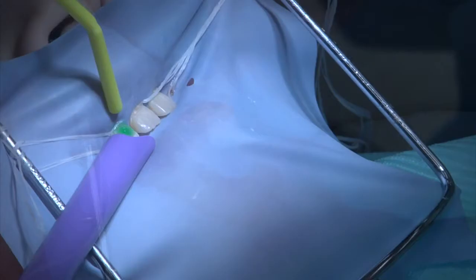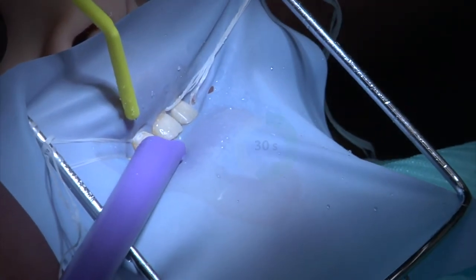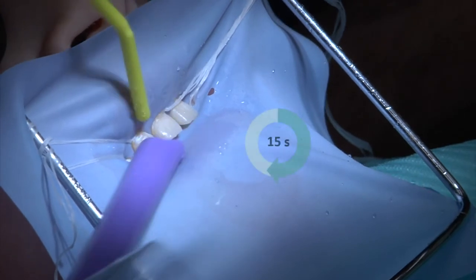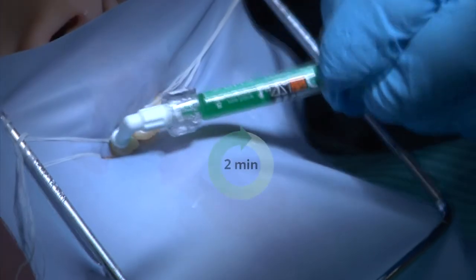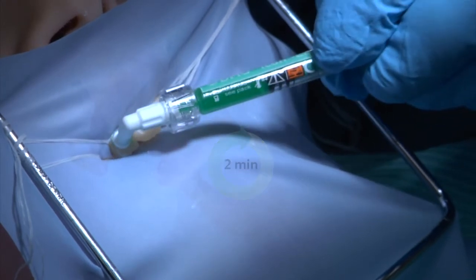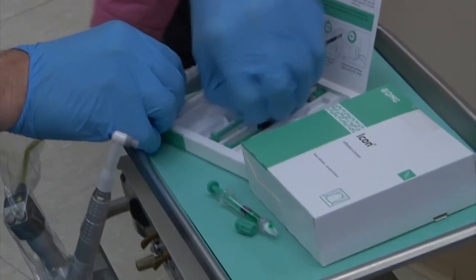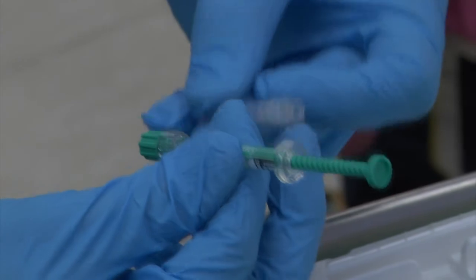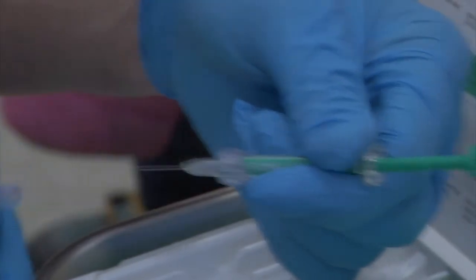At the end of the 2 minutes, the acid is gently rinsed from the surface with water spray for 30 seconds, and then dried with oil-free and water-free air for 15 seconds. A second 2-minute etch step is then indicated. The same applicator tip can be used again. Then, in order to allow for the complete desiccation of the enamel and to maximize penetration of the Icon resin material, an ethanol solution, Icon Dry, is applied for 30 seconds over the entire treated surface. This is accomplished by screwing on the needle applicator to the Icon Dry syringe and extruding a few drops of ethanol onto the lesion.